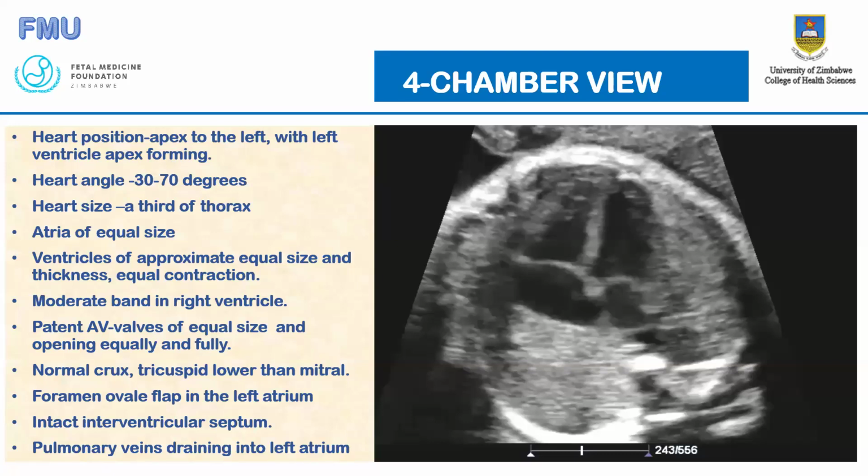Therefore, anyone who scans fetuses should be well versed with screening of common fetal heart abnormalities. It is important that we all get the competency of examining the fetal heart.